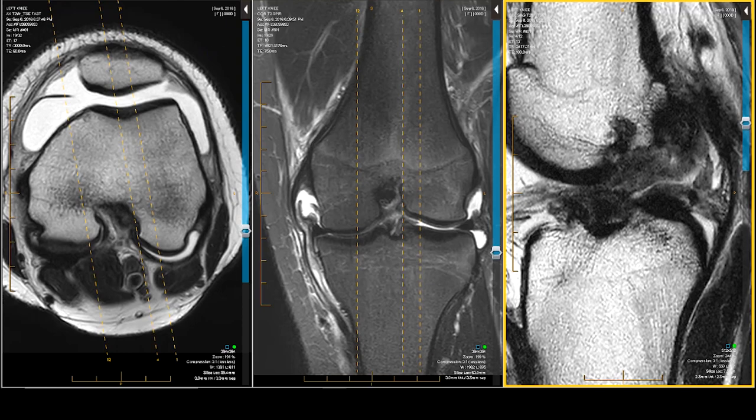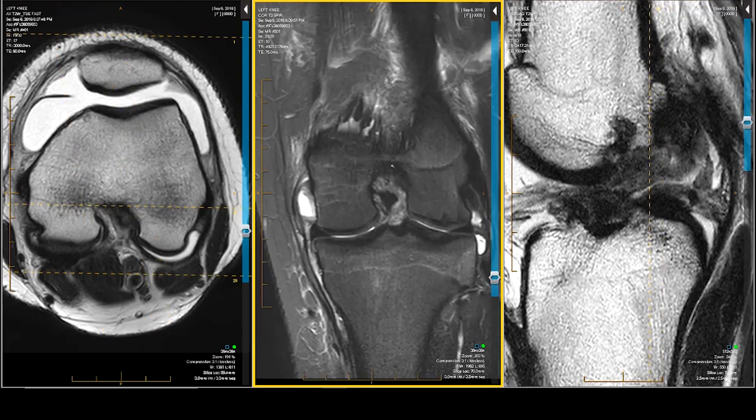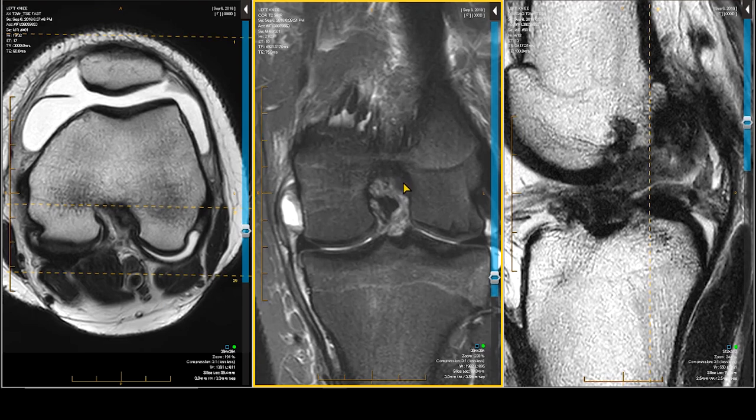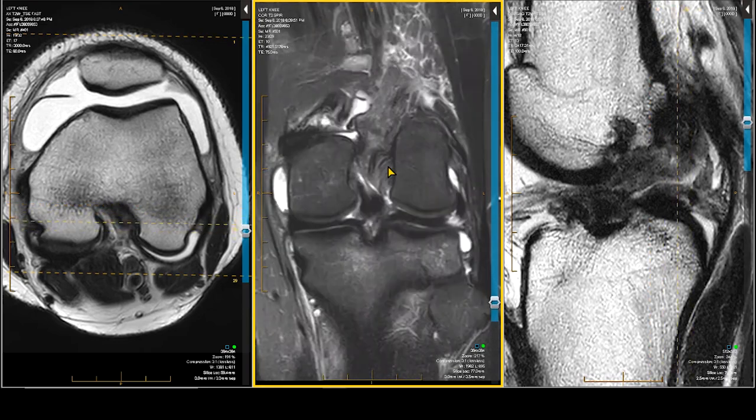We can confirm that in the coronal projection. There's our ACL — it's going on the road to nowhere. It stops right there. That is all ripped, destroyed tissue. But this is the meniscal section, so there's got to be more wrong than just that.